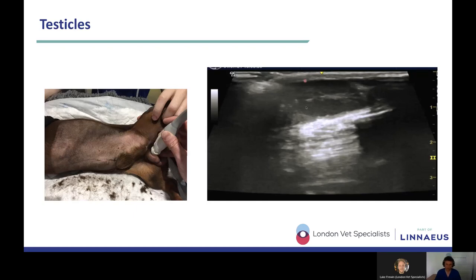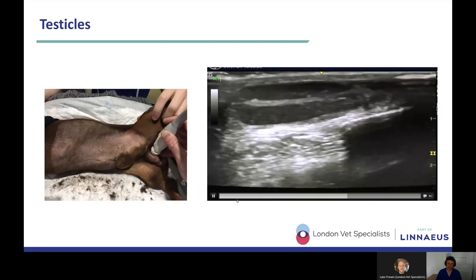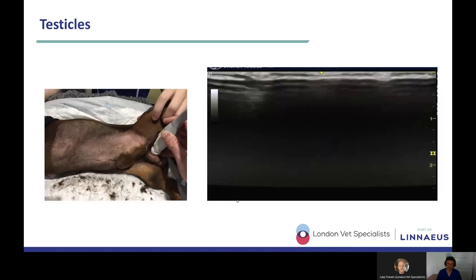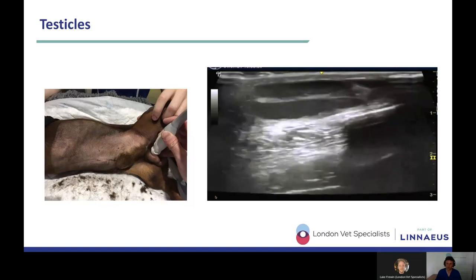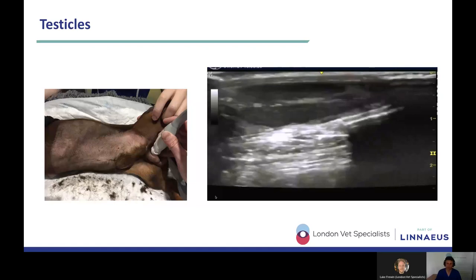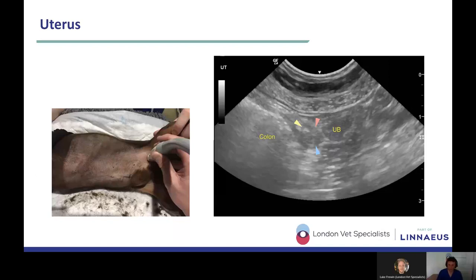Now, there's no chance of us confusing this as being anything other than the testicle in this dog, because the testicles are in a normal location. And just the same as for any other structure, you fix the probe and you fix your structure in the center, optimize your image, depth, focal point, time gain, etc. And then you just fan your probe right the way through the middle of this structure, making sure that you've looked at every part of the testicle, testicular body, epididymis, etc. And this is a pretty normal looking testicle. So those are the testicles.